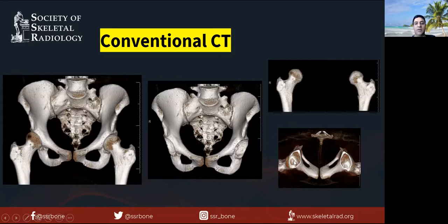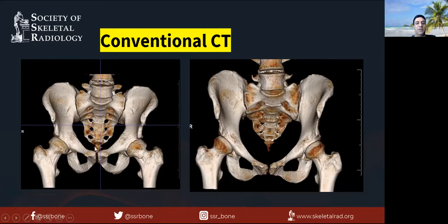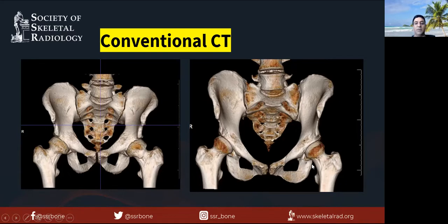A cutout view is created to see if there is excessive under-coverage or over-coverage of the femur head compared to the acetabulum. These conventional CTs highlight differences very well when volume rendered images are created. You can see the femur head and neck bumps and the posterior pelvic tilt, with very little gap between the pubic symphysis and coccyx — normally 2.3 cm in males and 4.6 cm in females. Here there's excessive gap, indicating anti-pelvic tilt. This is a dysplastic hip with a more shallow acetabulum and chopped-off femur heads due to gluteus minimus impressions.